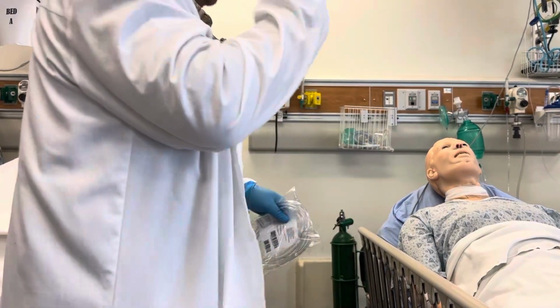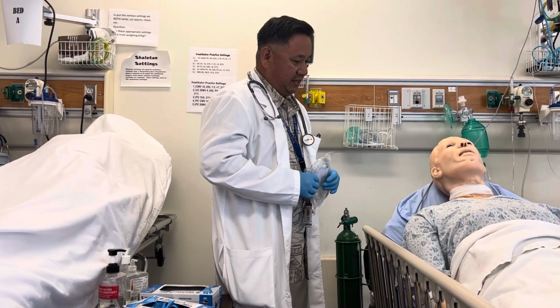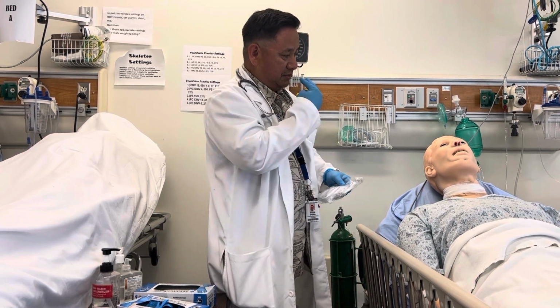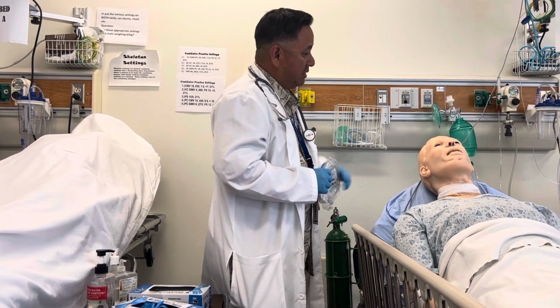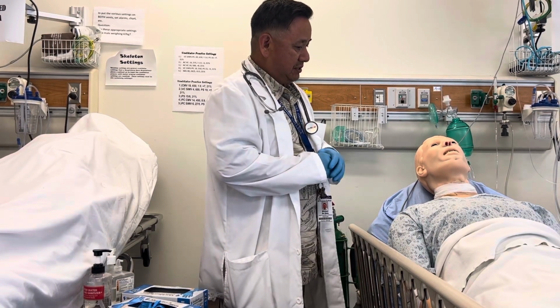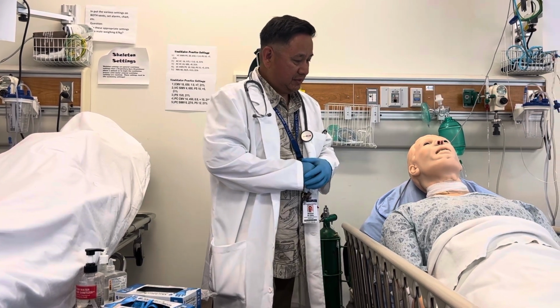Enter the room. Hello, Mr. Johnson. My name is Mike from Respiratory. How are you today? Good. I need to place you on a little oxygen with a nasal cannula today. It's a little device that I'm going to put inside your nose and hook up to oxygen, okay? First thing I need to do, though, is take some vital signs from you. I'm going to take your heart rate, respiratory rate, and I'm going to auscultate. Is that okay with you?